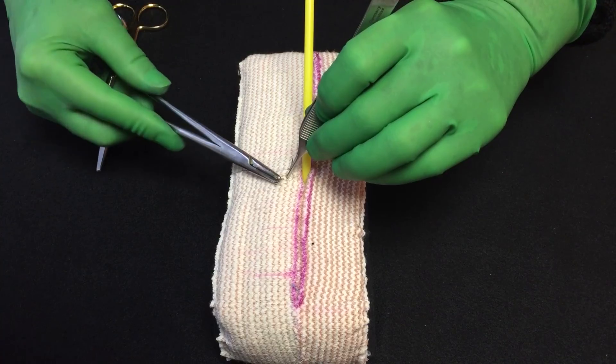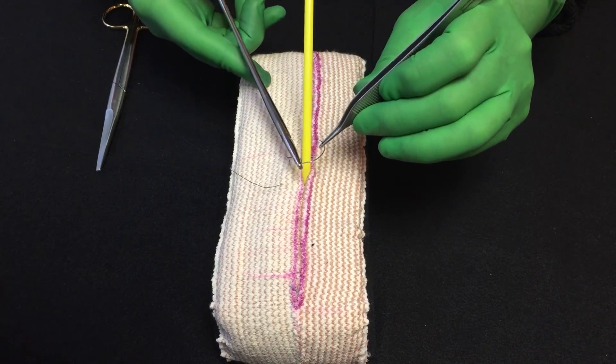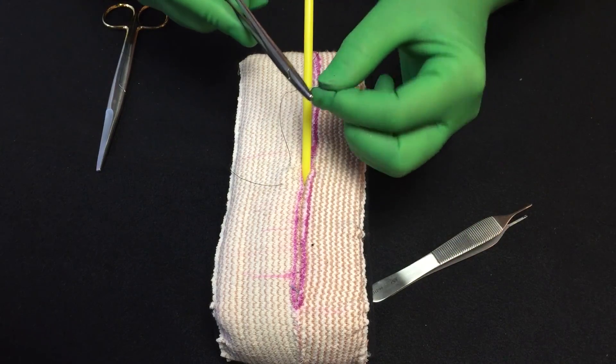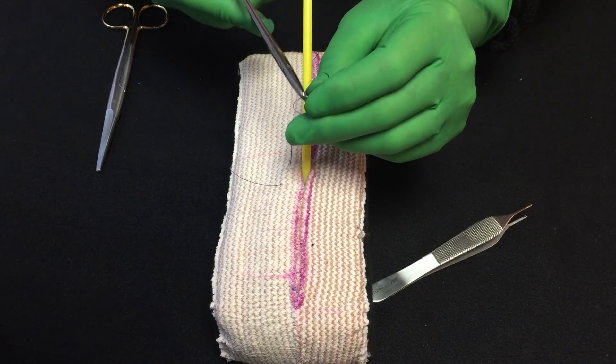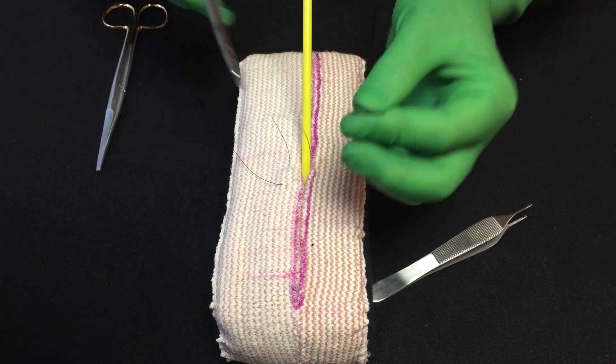Take a throw with your needle. An easy way to undo a needle if you want to, if you don't have the scissors there and the scrub tech is busy, you can just put your needle holder right next to the needle and bend and it comes right off.